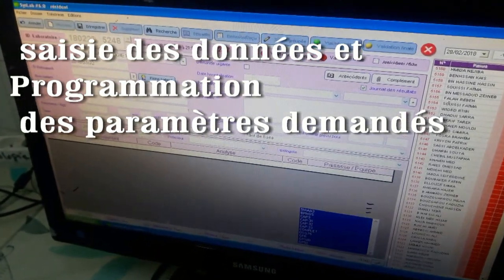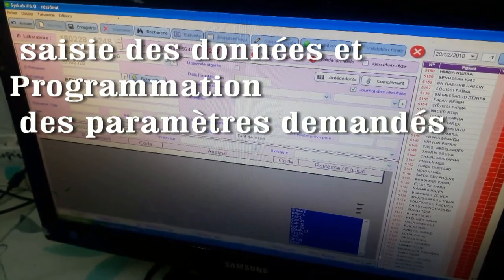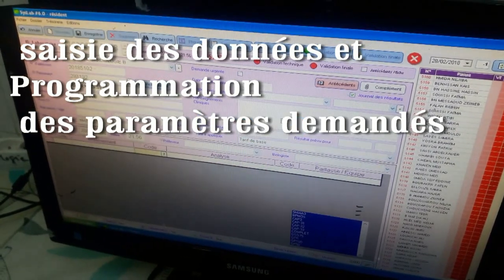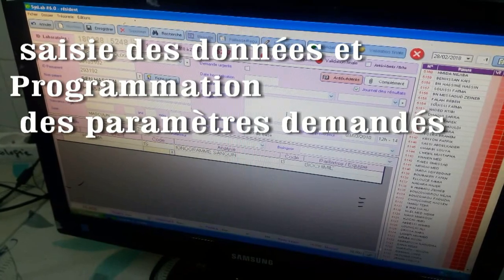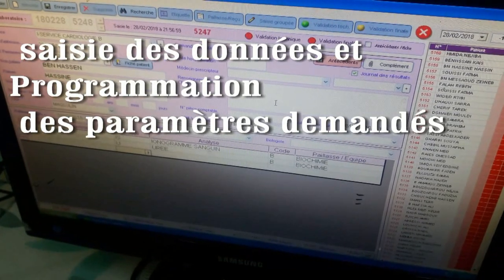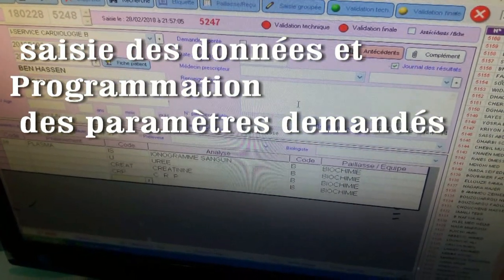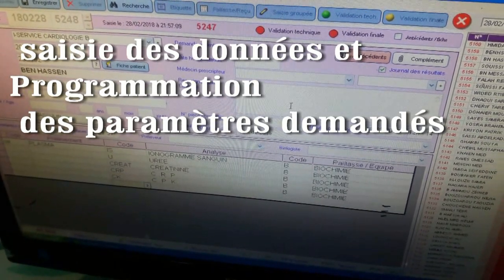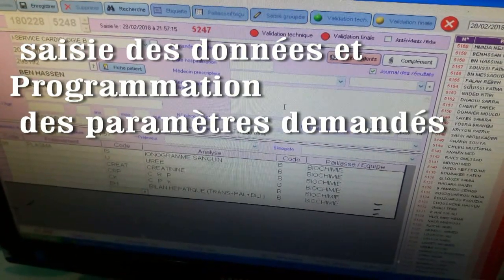On saisit le nom. Donc IONO, l'abréviation IONO IS — IONO sanguin. URE, CREAT — créatinine. CRP, CPK — CK. Bilan hépatique : transaminase, phosphatase alcaline, bilirubine totale. On ajoute gamma-GT et bilirubine directe. Acide urique — AU. Calcémie — CA.